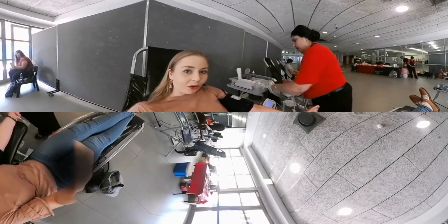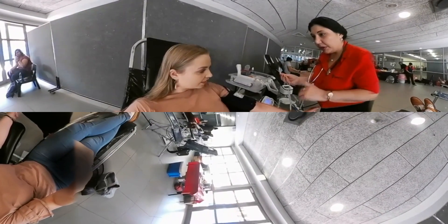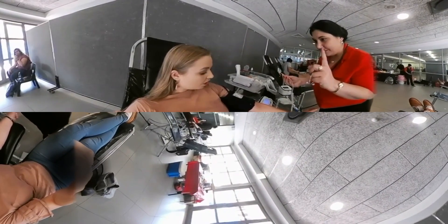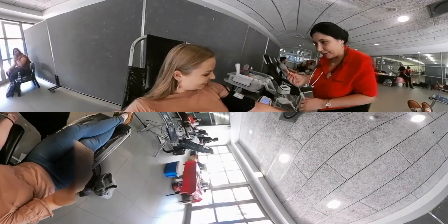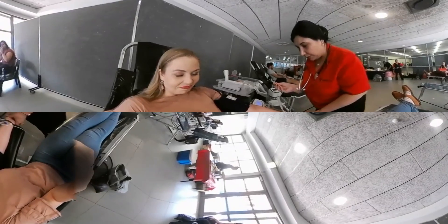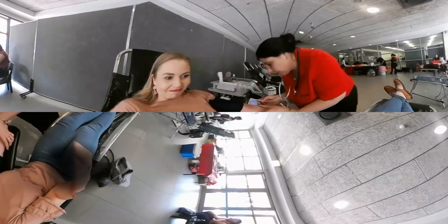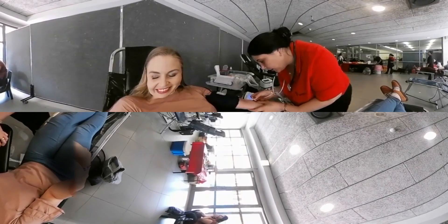I'm starting to get a bit nervous. The nurse tells me to take a deep breath and asks if I still want to watch. She tightens the band and reminds me to keep my arm straight. She inserts the needle and says it's running — and that's it, that's all.